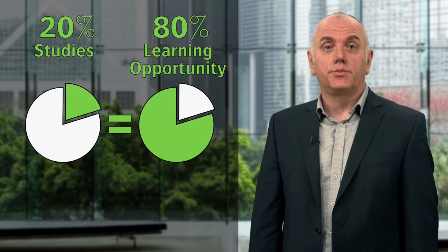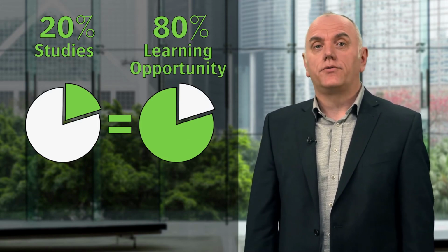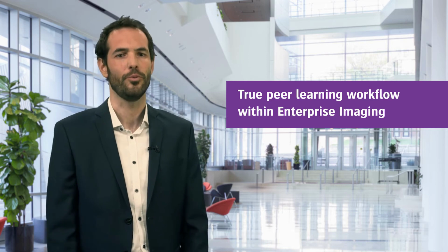Now, although traditional peer reviews are initiated with the best intentions, there are several drawbacks to them. Generally, 20% of the studies present 80% of the learning opportunity. So by randomly selecting studies for peer review, a lot of learning opportunity is missed. There is also very little feedback to the report author, and the scoring of the reports often leads to blame culture. That is why we developed our module much further, so it supports a true peer learning workflow within our enterprise imaging platform, and not only peer review.